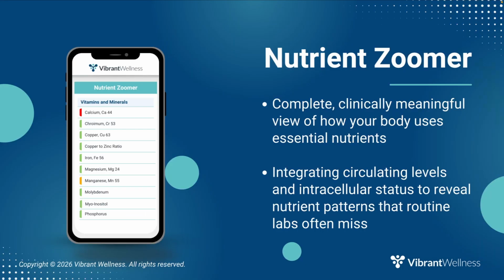Vibrant's Nutrient Zoomer provides a comprehensive, clinically actionable assessment of how the body utilizes essential vitamins, minerals, and key nutrient-related biomarkers. Rather than looking at circulating levels alone, the test integrates serum markers with intracellular and functional indicators to uncover deeper nutrient patterns that routine labs often overlook.